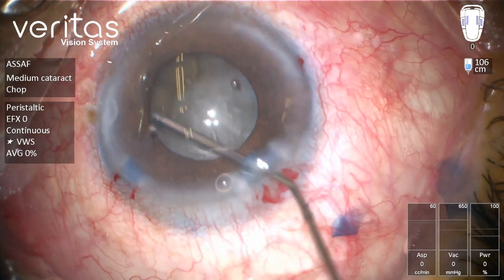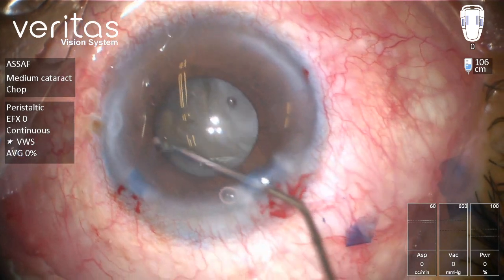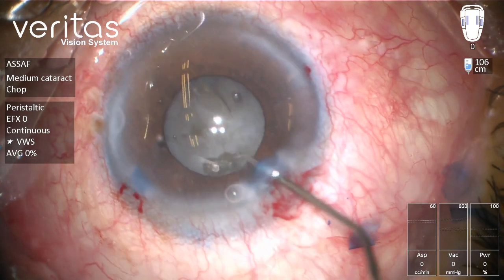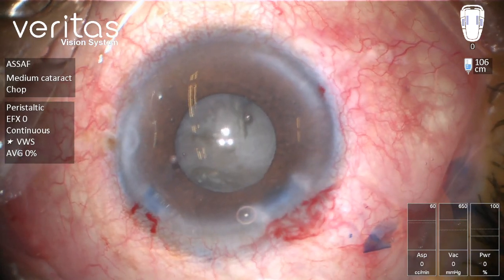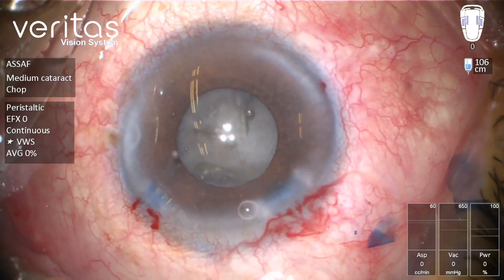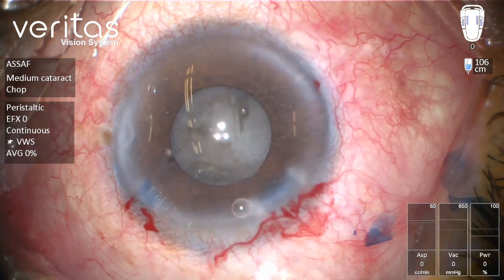In this case with suspected zonular weakness, we could probably use one of those capsular hooks to support the zonules in the vertical meridian, but let's see how it goes without using those supporting devices.